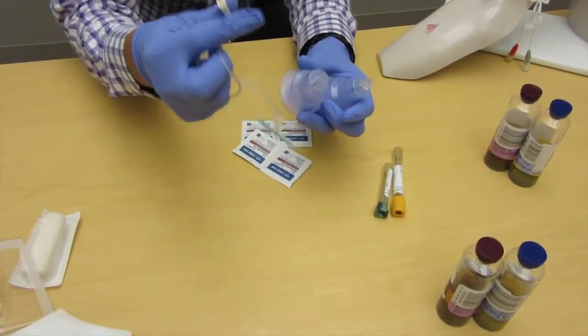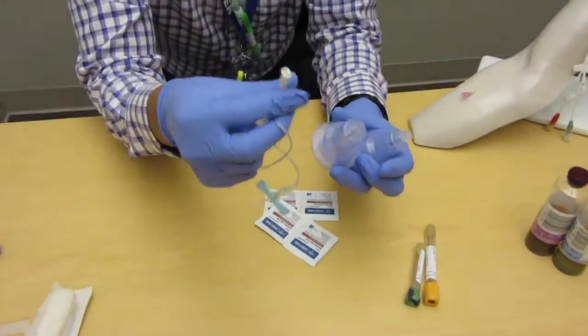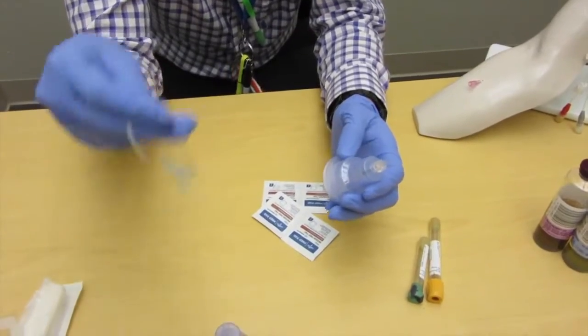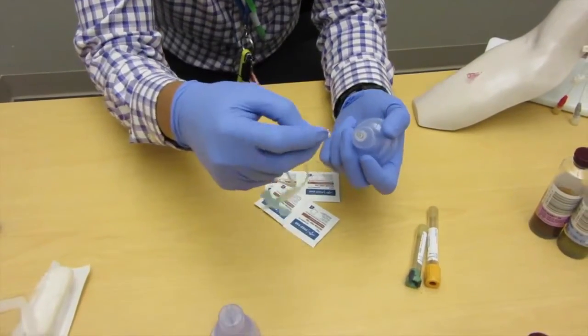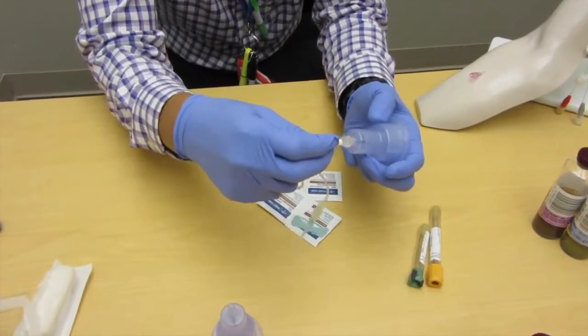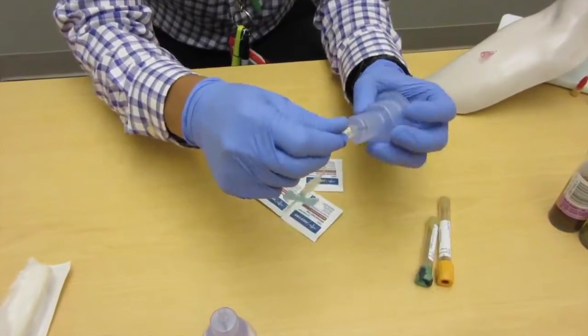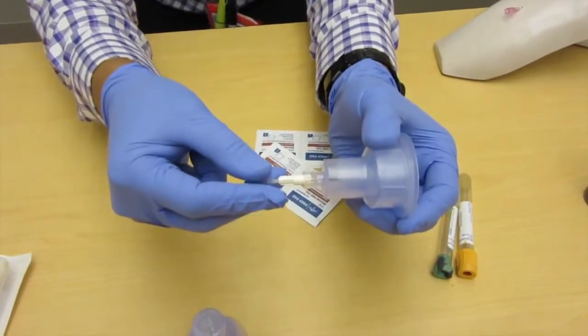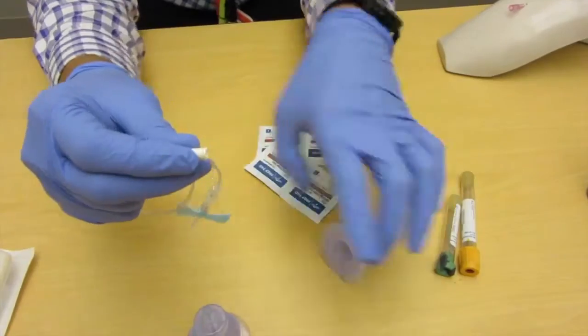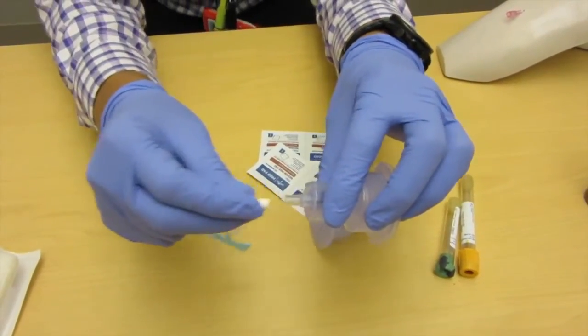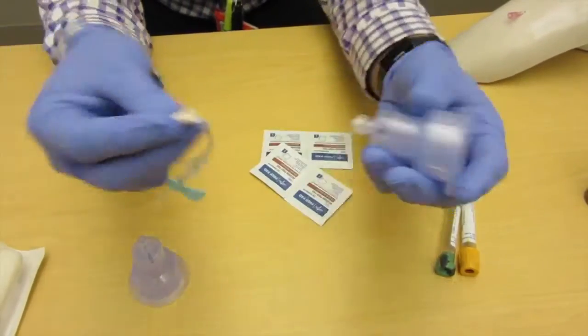What I'm going to do is connect the male end to this female end right here. Just make sure you get the correct one—it's a luer lock connection. If you got the wrong one, you're wondering, 'Hey, what happened? This doesn't work.' Just make sure you get the correct one.